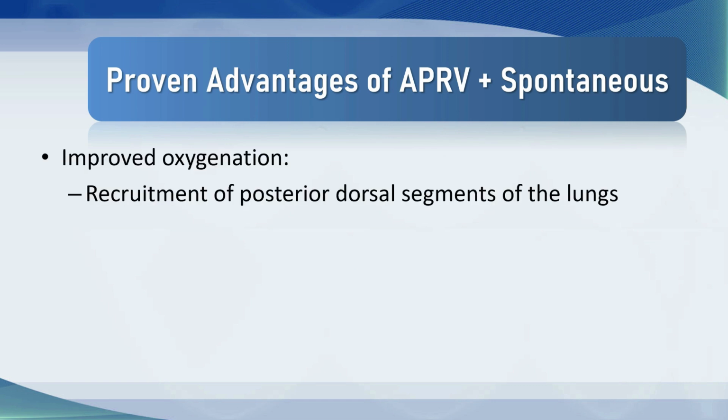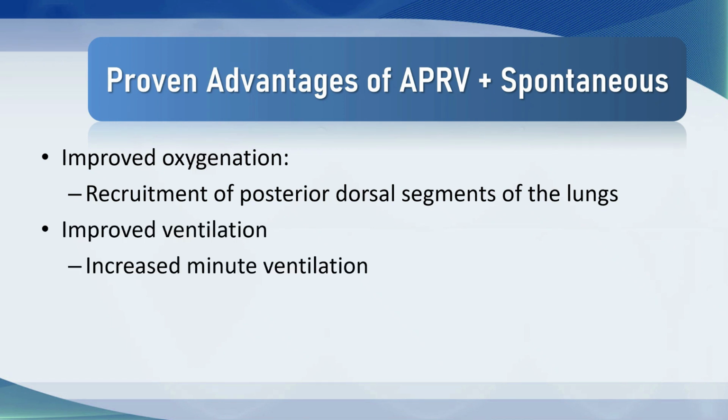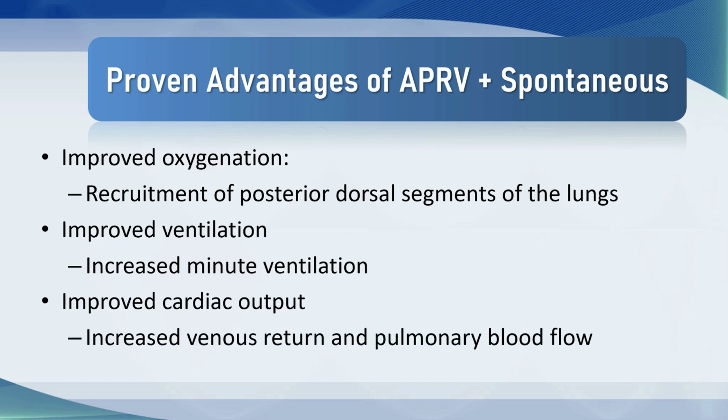The first thing is that oxygenation is unquestionably improved because of recruitment of the posterior dorsal segments of the lungs. Secondly, there is improved ventilation, and what I mean by that is carbon dioxide clearance is enhanced due to increased minute ventilation. There is also an increase in cardiac output due to an increase in venous return, increased pulmonary and global blood flow.